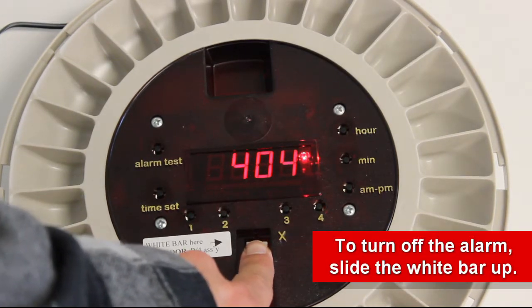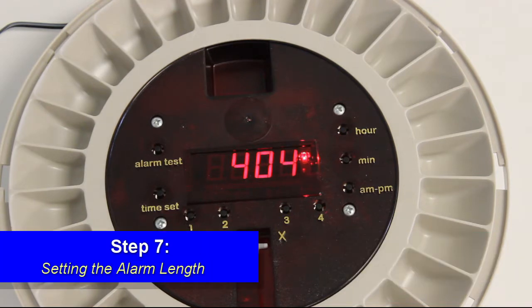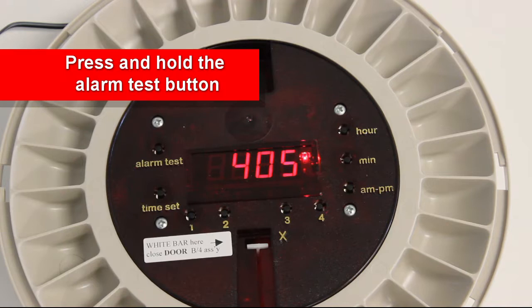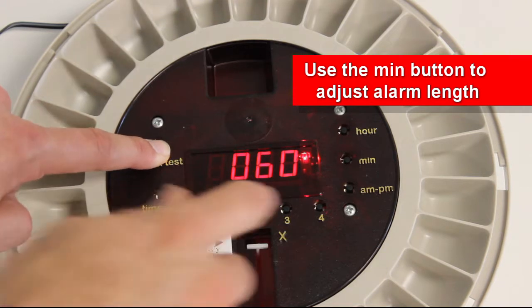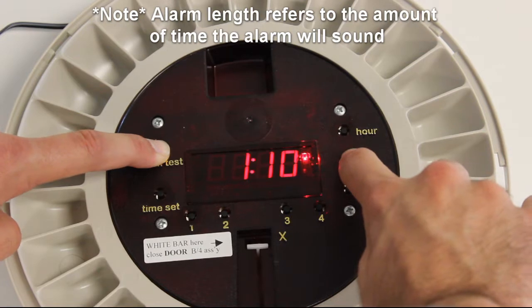Slide the white bar up if the alarm goes off. Step 7: Setting the alarm length. Press and hold the alarm test button, then simultaneously press the minute button to set the alarm length. Release the buttons when it is on your desired time length.